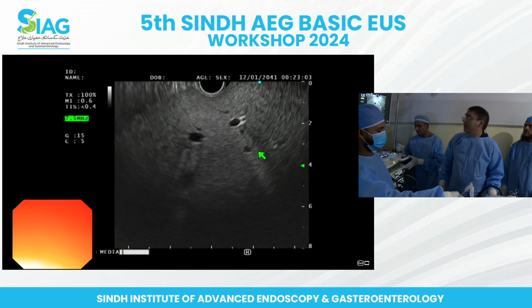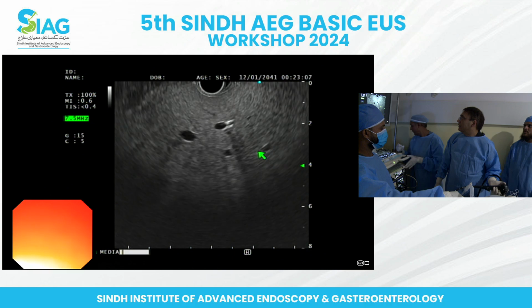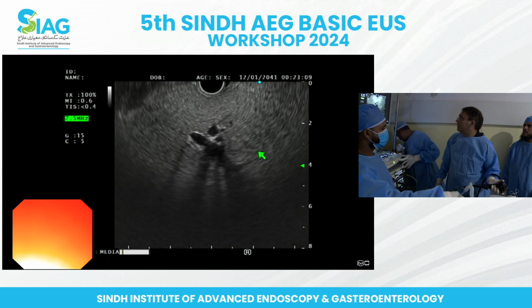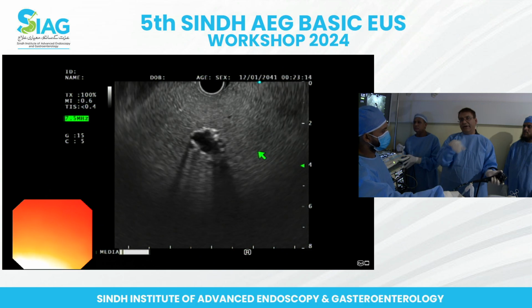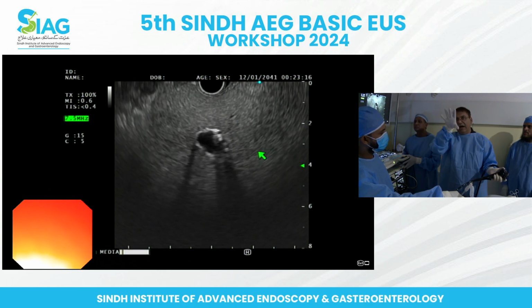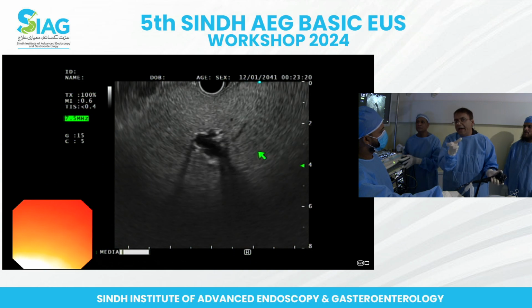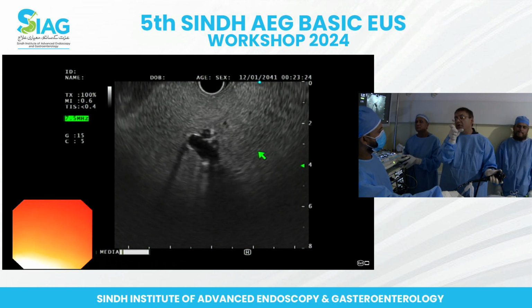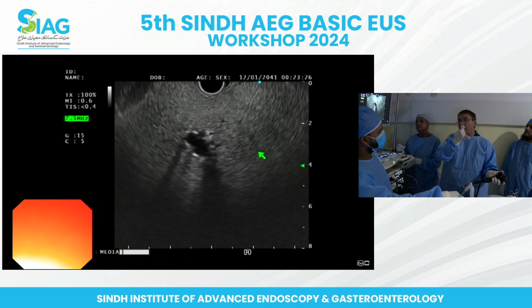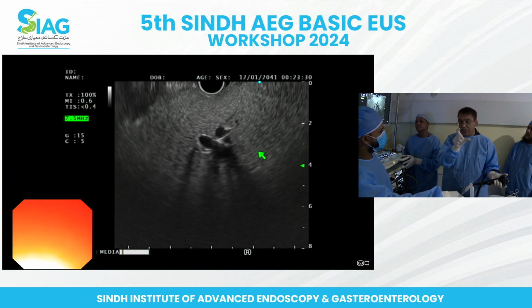Khalid, that was very well demonstrated. Especially, I thought it's the other way around. Left is easier, but you made the right look very easy as well. Right is much easier. Left you get confused sometimes because there are branches there, but the left hepatic vein is easy to find. The mid hepatic vein sometimes gives you confusion because there are different branches coming out, and also the left and mid hepatic veins sometimes have the same origin.